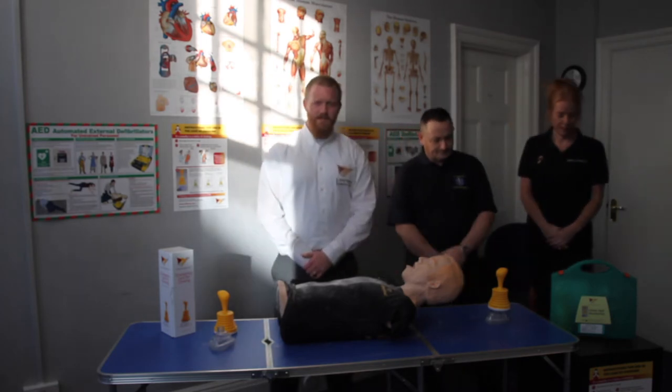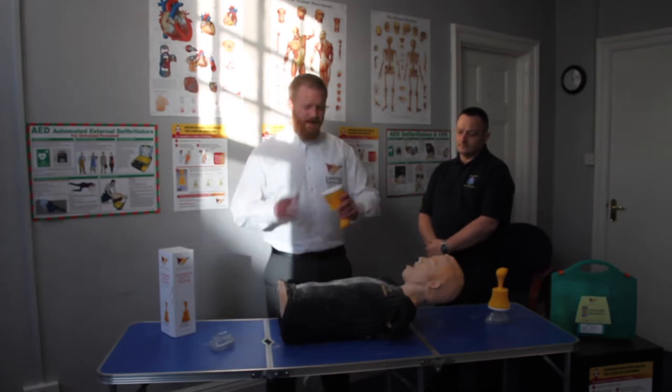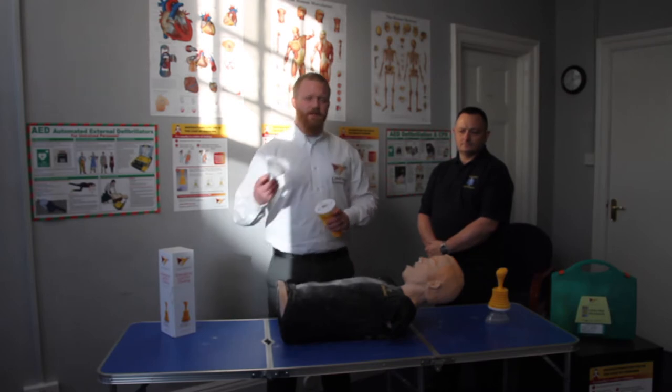In this video today, we will explain how to use LIFEVAC in a choking emergency situation when BLS choking protocols have failed. We'll also be explaining a little bit about LIFEVAC. LIFEVAC is a non-invasive, single-suction, anti-choking device. It has a patent one-way valve and two sonic welded discs for different size masks.